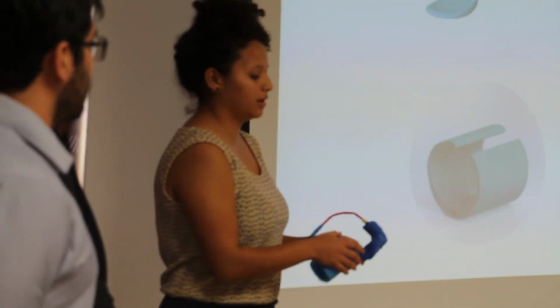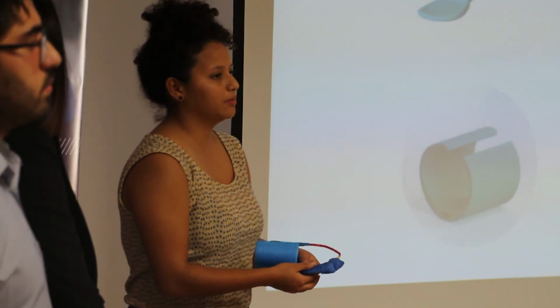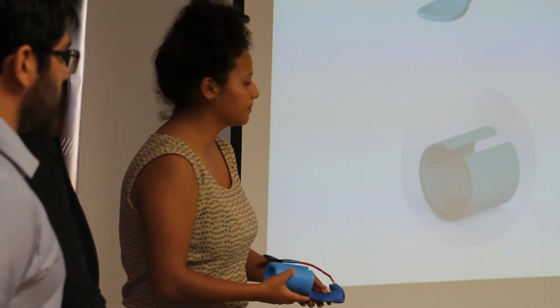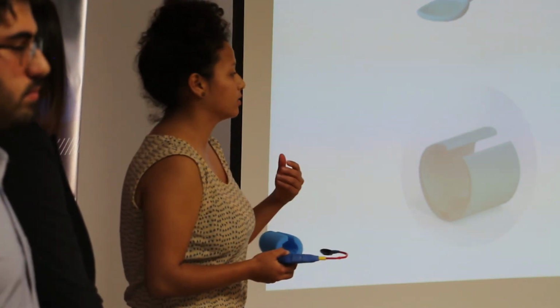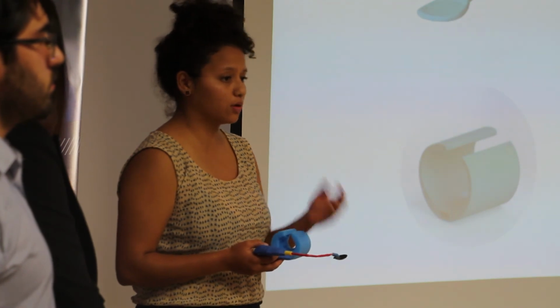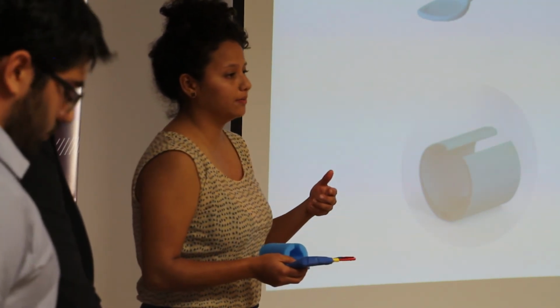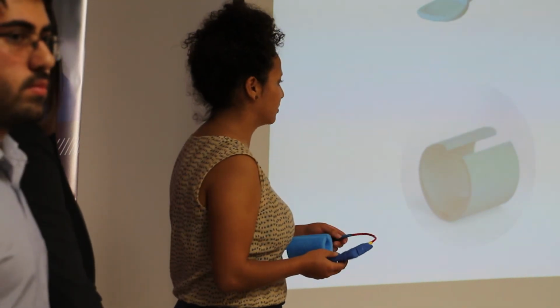Also, it's going to have an articulated part that may be fixed in the place that is necessary for this kid. And it's going to have the spoon, which has a curved form that may help them carry the necessary food by themselves.